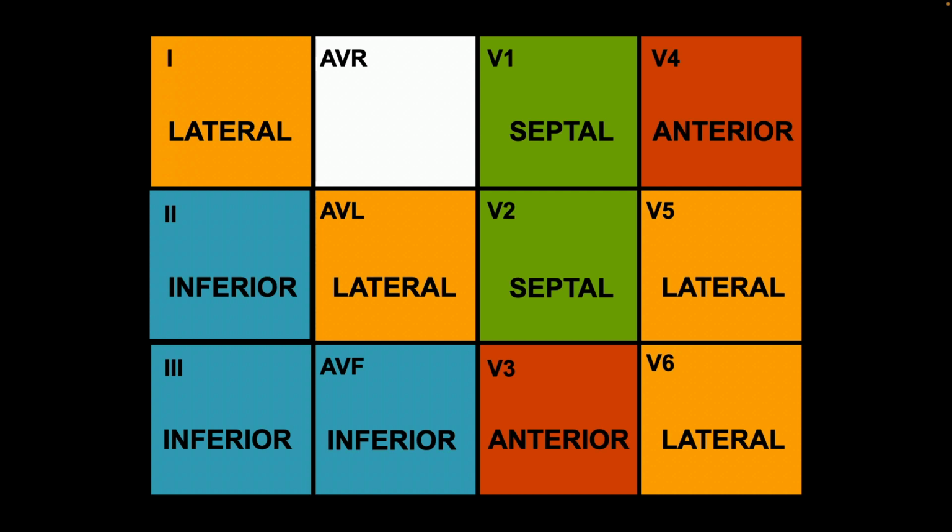There are what we think of as the mimics, and we will be getting into them, not today, but a big one is left bundle branch block, pericarditis, something called early repolarization, the old name is benign early repolarization, and left ventricular hypertrophy. All these things are going to make your life miserable.